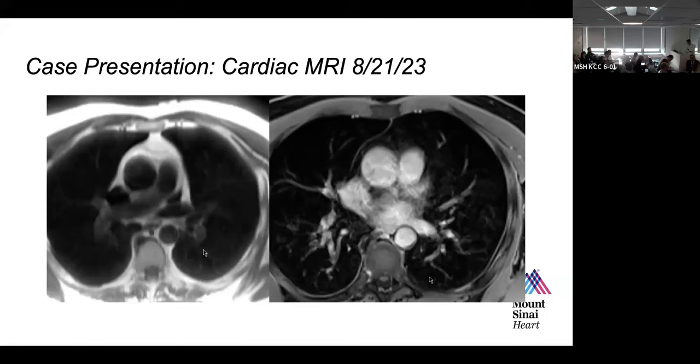Yeah, absolutely, and we actually push these into a 3D workstation where we can move it around with a crosshair and a rotation center. We can look at it in all different views, the coronal, sagittal, as well as the axial that we see here.